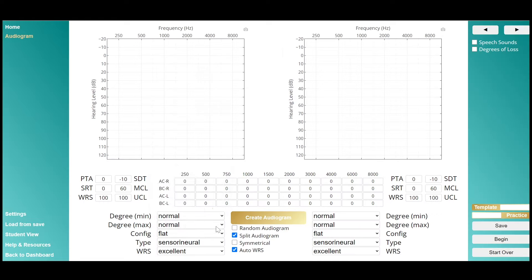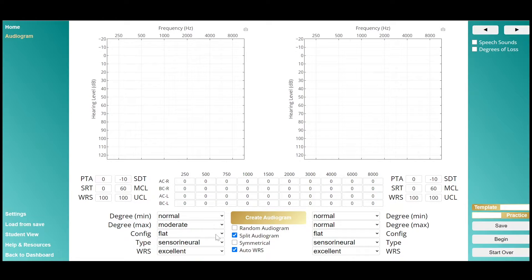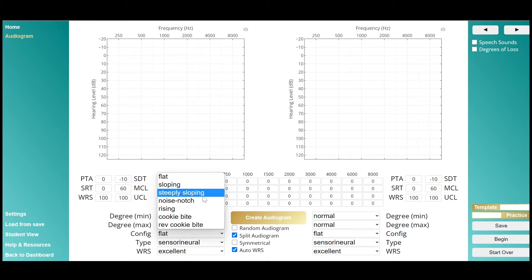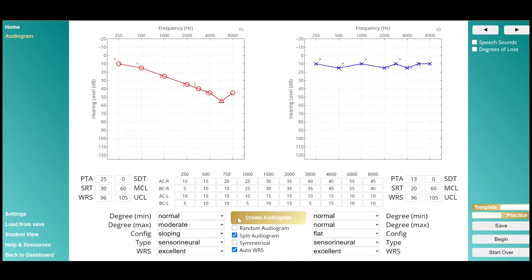Let's design an audiogram-only case. Here you can use the drop-downs to quickly design a hearing profile, which can then be saved for later, or you can jump in and start right away.